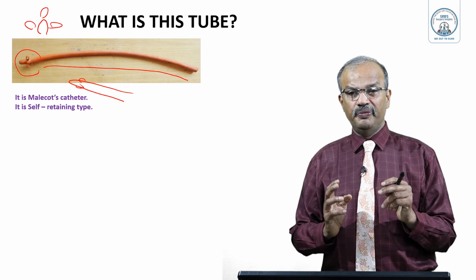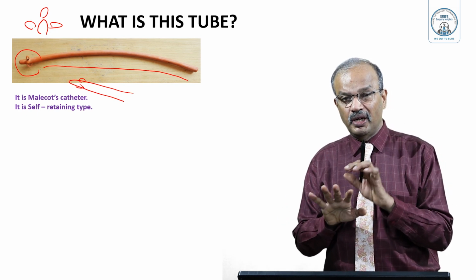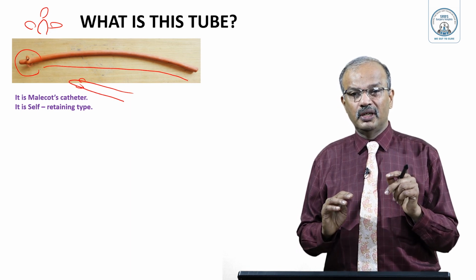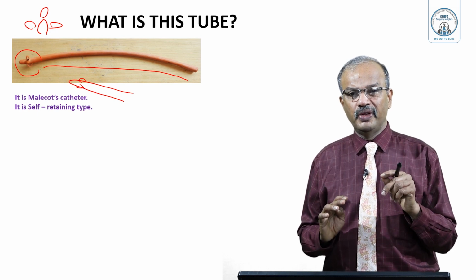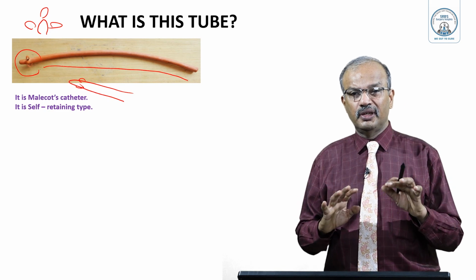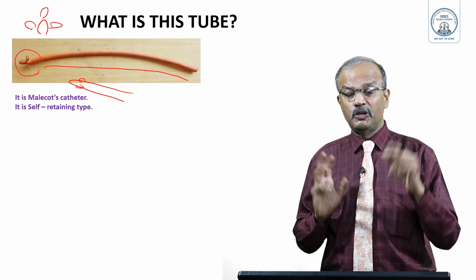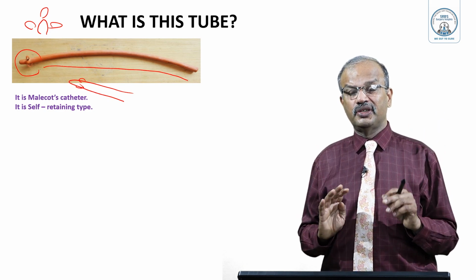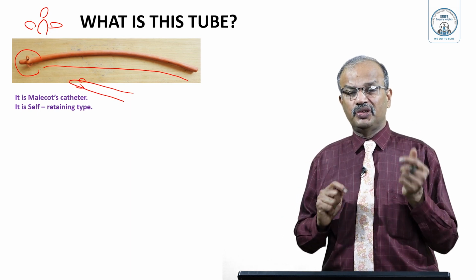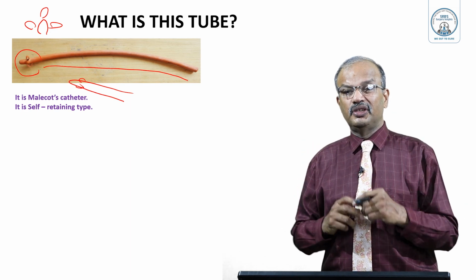So make an incision, confirm that the bladder is full. Clinically by percussion, the infraumbilical area will be dull, or after that do an ultrasound and reconfirm it. Give local anaesthesia just above the pubis and make a small incision of 2 cm, and the skin, subcutaneous tissue, anterior rectus sheath are opened. Then you can directly, in the extraperitoneal space, push the peritoneum above the dome of the bladder, pass a needle and aspirate with the syringe, confirm that it is urine and urine only. You can see the crisscross detrusor fibers. Then put a stay suture using Vicryl or catgut. Then hold it properly, then make a small incision, and urine comes out.